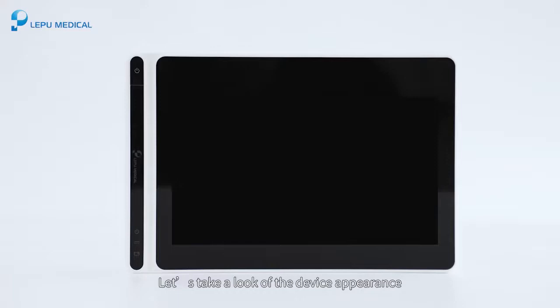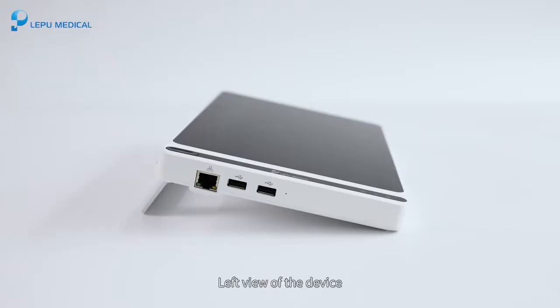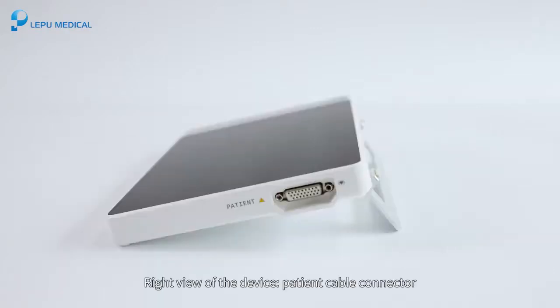Let's take a look at the device appearance. The front view. Here is the button of power on off. Power on indicator. DC power indicator. Battery indicator. Left view of the device. Network connector. USB connector. Microphone. Right view of the device. Patient cable connector.